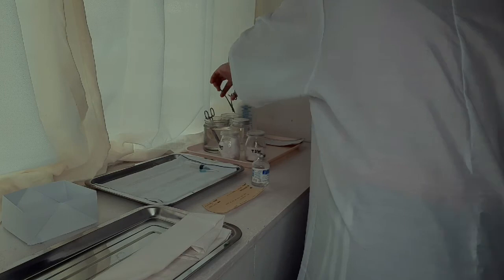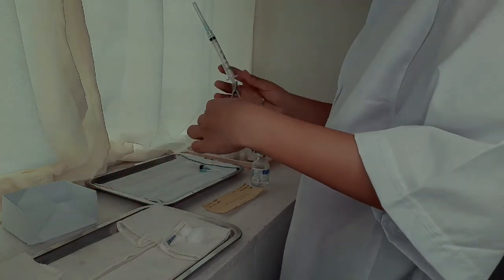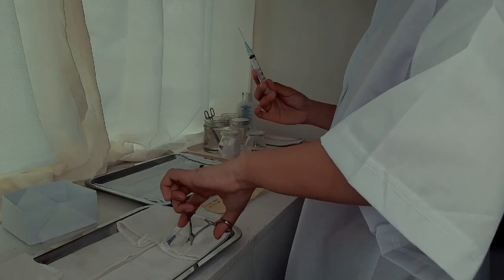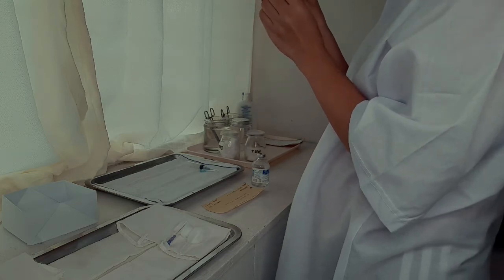Since the gauge 23 aspirating needle is already attached, there is no need to change it at this point. Instead, proceed to aspiration of 0.5 ml air and inject it into the vial. Aspirate 0.5 ml of the medication, pull the plunger down and change the needle. Align the bevel and the calibration. Return the syringe to the injection towel.